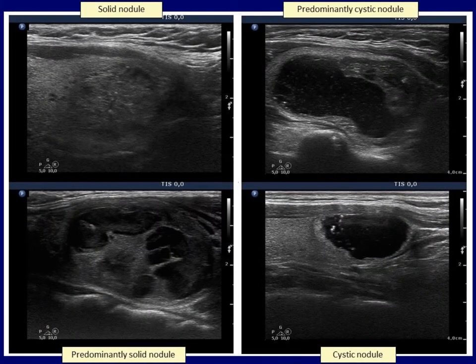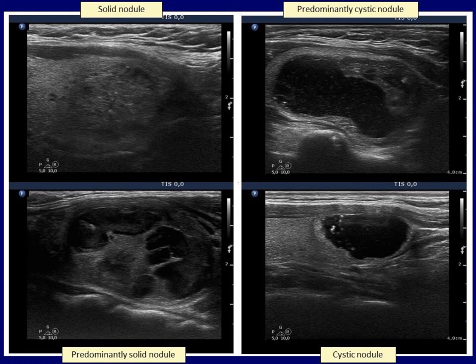This table refers to basic terminology. Although the left upper nodule shows tiny cystic areas, the sum of these areas is surely below 5%, so this nodule should be classified as solid. In the left lower case, the solid parts exceed the cystic areas; however, the cystic amount is above 10%, therefore this nodule should be considered predominantly solid.